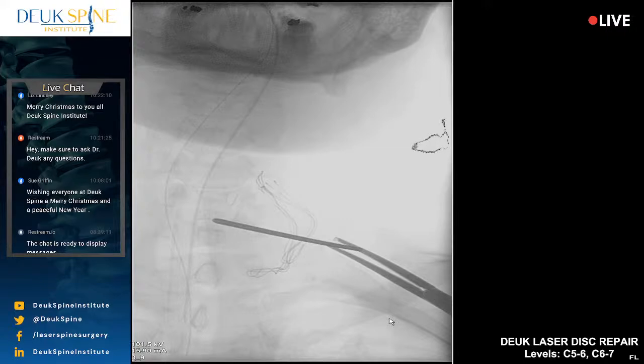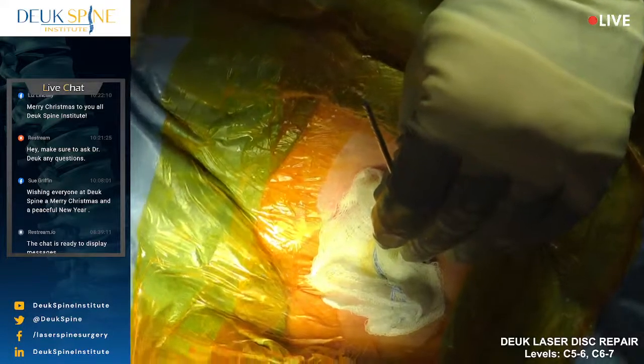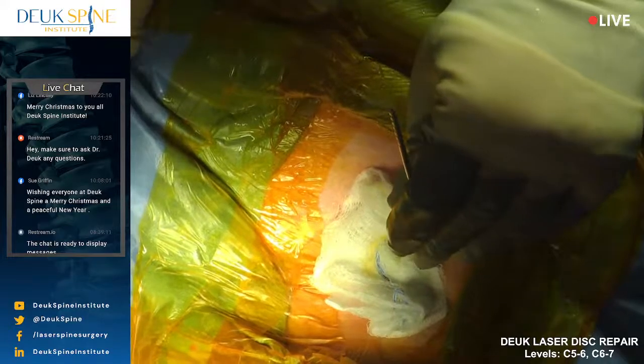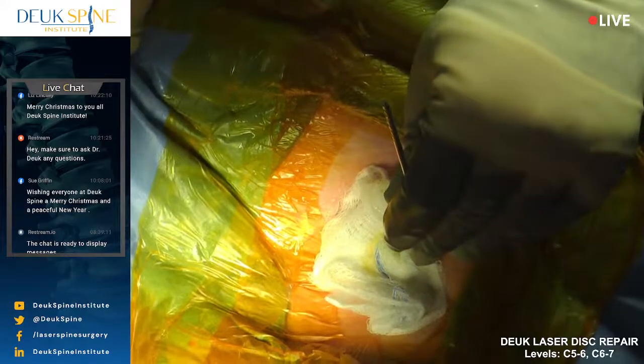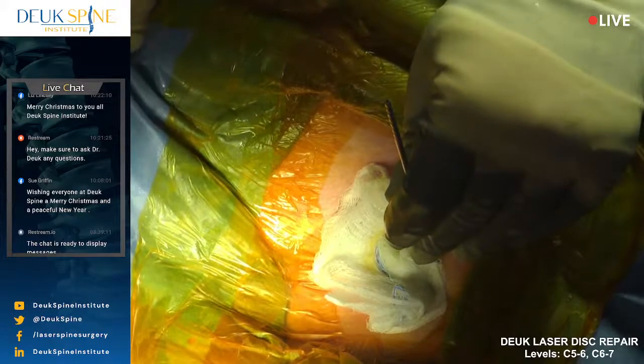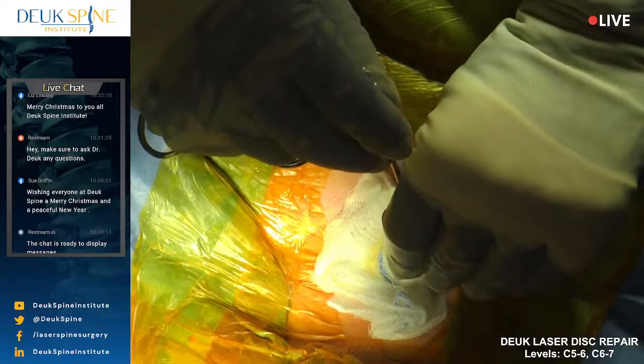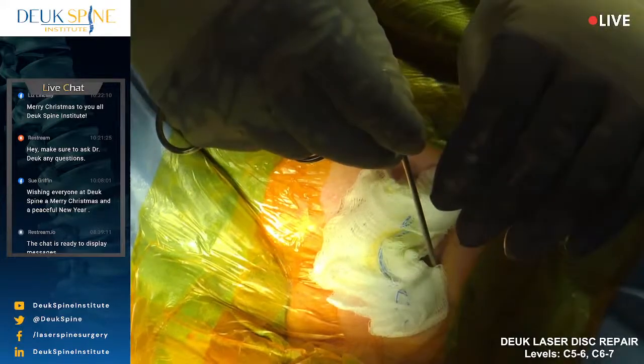Since we're going up the spine towards the head, it's easier to see because the shoulders are not in the way of the X-ray machine. So we actually get a clearer picture as we move up. I'm hoping for a clearer picture and a little bit less effort on my team's part. Good, good. I'm going to march up the spine to the next disc. Shot.